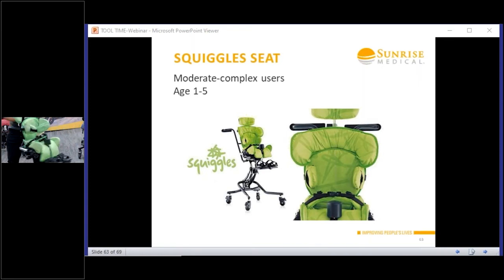Hip guides. So you've got adjustment on here for your hip guides. The hip guides are part of the pelvic belt as well. So they're going to adjust as you go wider or narrower. That's going to give you that adjustment as well. So it's just going to be 5mm. It's going to give you that width. So you see that adjustment on either side, and that's just going to then adjust the belt and the actual hip width so you have full contact.